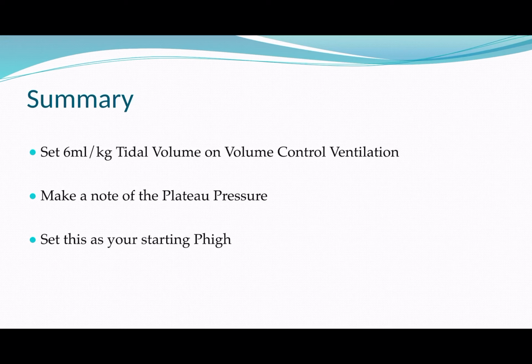So again, if you're looking after patients who have large collapsed areas of lung or even one complete lung that's collapsed, be careful about how you start them on APRV, or if APRV is actually the right option at all for those patients. Because actually what you want to try and do is to maximize the amount of blood flow into the ventilatable lung. And so conventional modes of ventilation might be better. We talk a little bit more about this in the advanced ventilation talks later in this series.